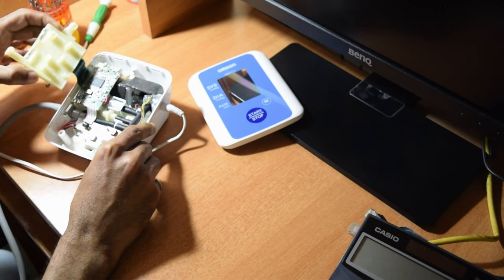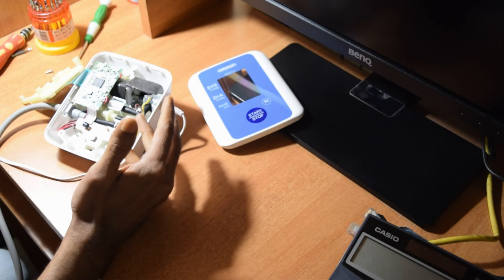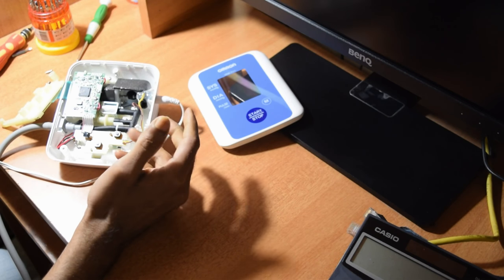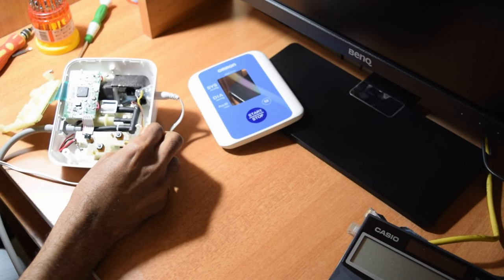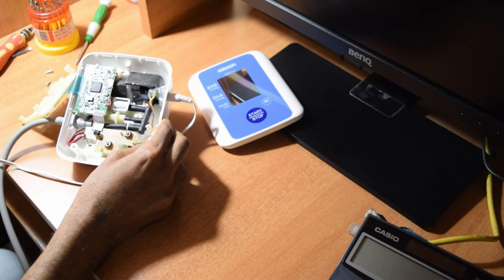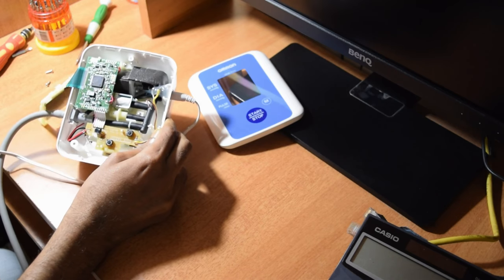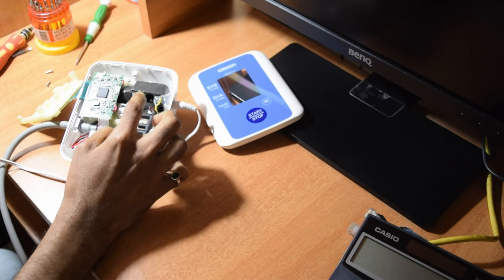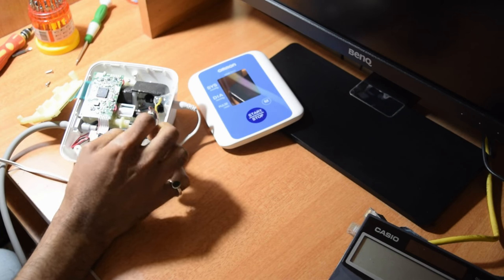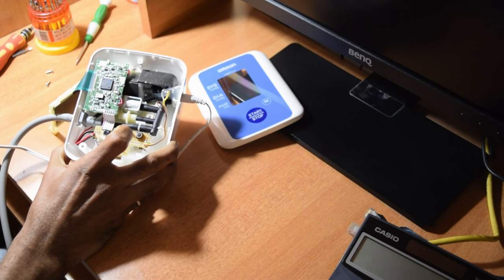One interesting thing, you can lift and then you can see the pump in action in case you want to tweak this, in case you want to connect it to any IoT device or some kind of Raspberry Pi. You can even do the same. That is where the fun part starts, because this is something I'm more curious about: any way I can interface to a database, and then I can automate or else put inside some kind of Arduino or microcontroller device where we can take these measurements and directly import them to a database or something like that.